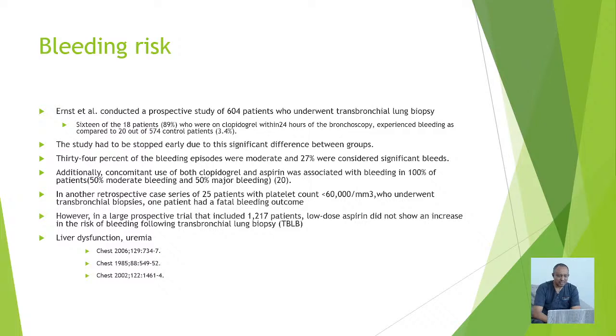So when this gentleman did his transbronchial lung biopsy study, he found patients who are on clopidogrel had a very high risk of bleeding. So checking what kind of medication the patient is on is very, very important. And specifically for clopidogrel, we need to stop it for at least 5 days before we do the procedure.